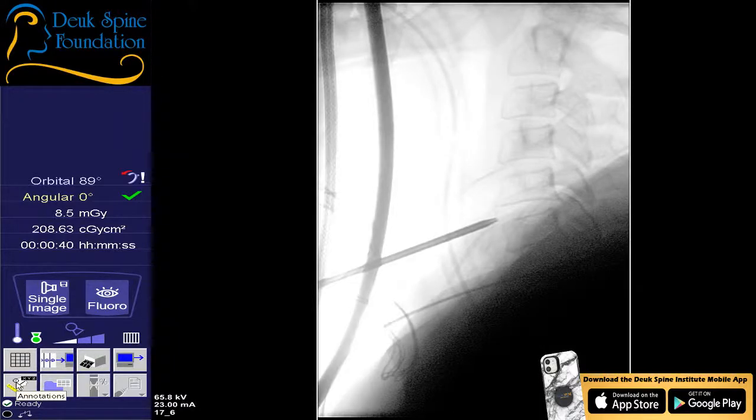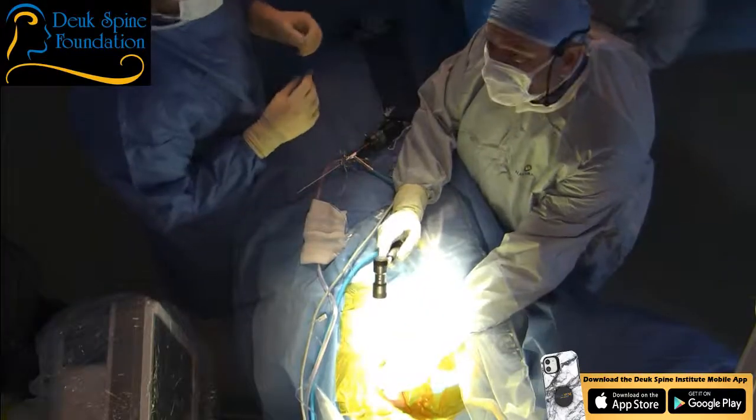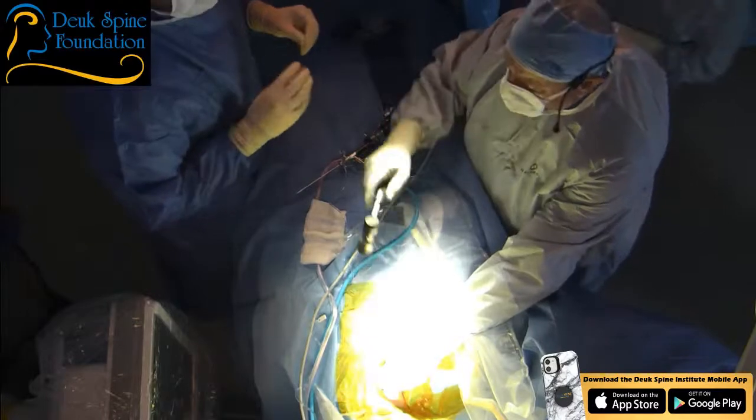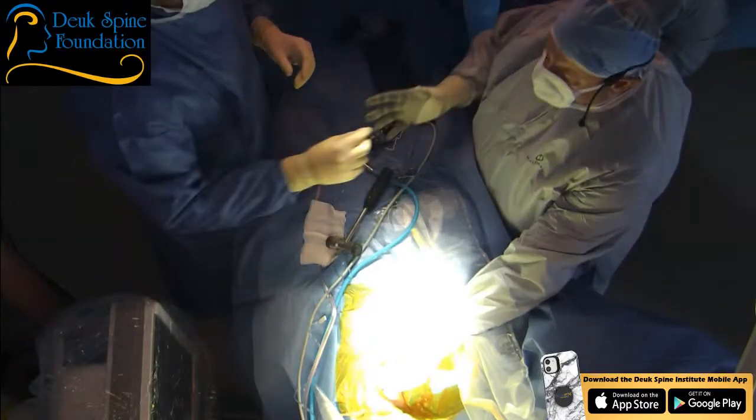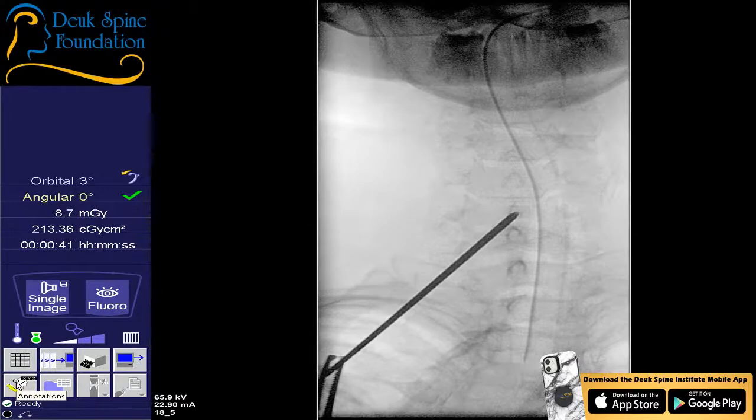That'll work. Shot. Let's get an AP. I just want to make sure it hasn't moved. Perfect. Lateral. A couple questions. Sure. One of our viewers is wondering, if this patient got whiplash, would this disc re-herniate?